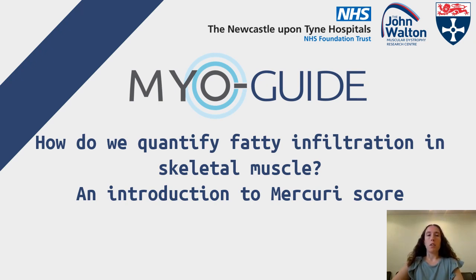I am an adult neurologist working as a clinical research associate at the John Walton Muscular Dystrophy Research Center within Newcastle University. And I'm currently working in the MYO-Guide project. And today, as part of it, I'll be presenting a summary on how we measure fat infiltration through MRI.